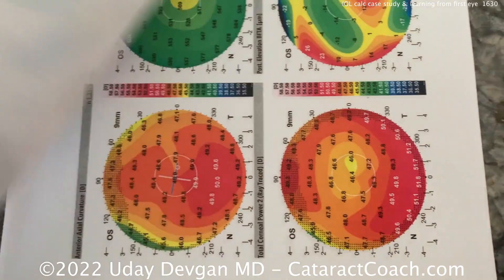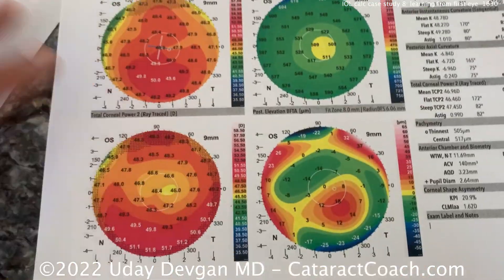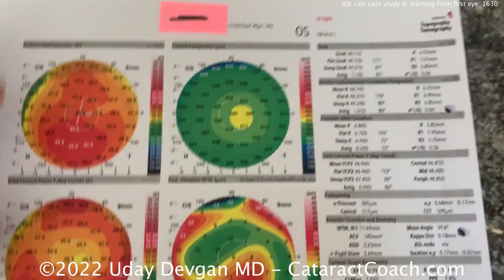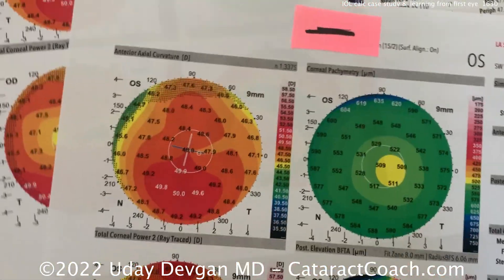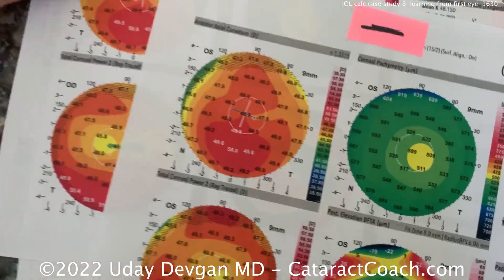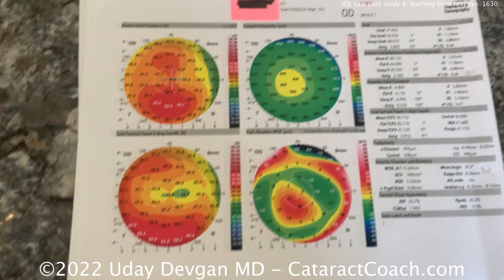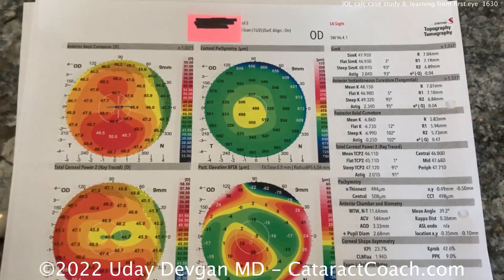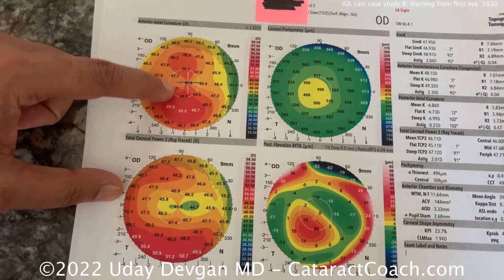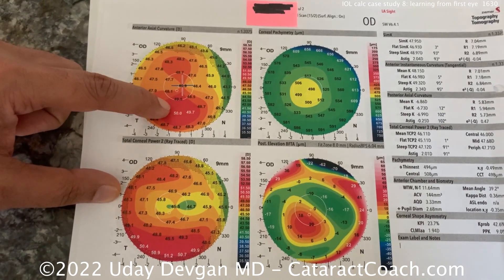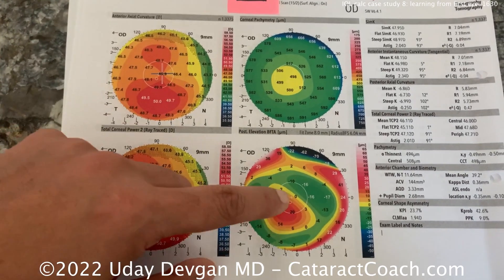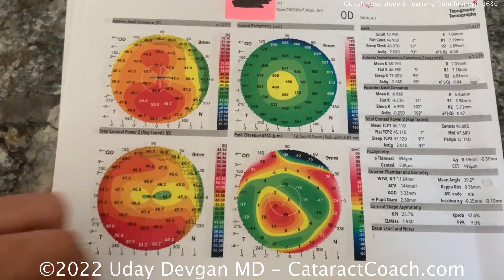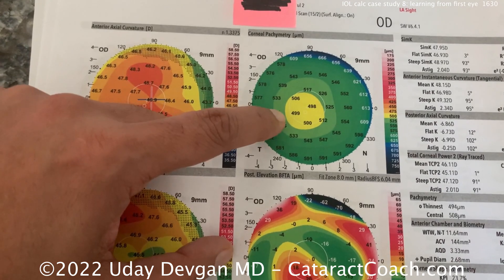Let's look at some of the other measurements. Here's the tomography. The right eye is the one we're going to operate on first. You can see a little asymmetry in the curvature if we look at the top versus the bottom. This is certainly not something I'd want to do LASIK on. You can see in the posterior float there's one spot here, and the cornea is a little thinner than normal.